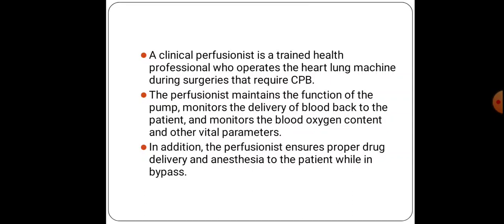The perfusionist also monitors the blood oxygen content, because it is one of the most vital parameters. If there is any depression of oxygen, some of the organs will not perform properly. They also monitor other vital parameters.